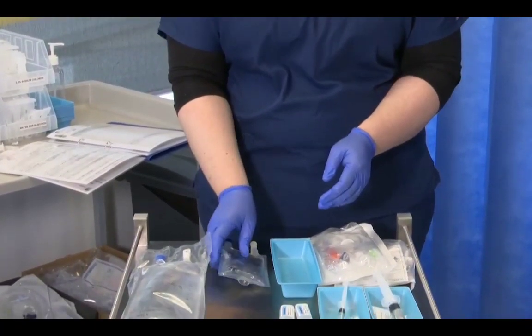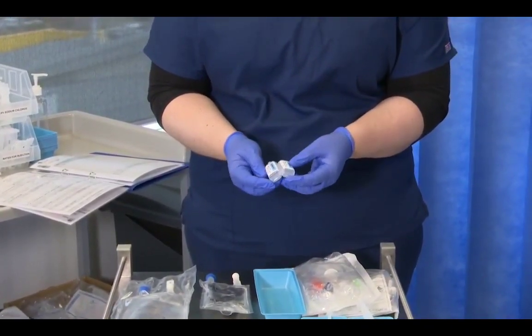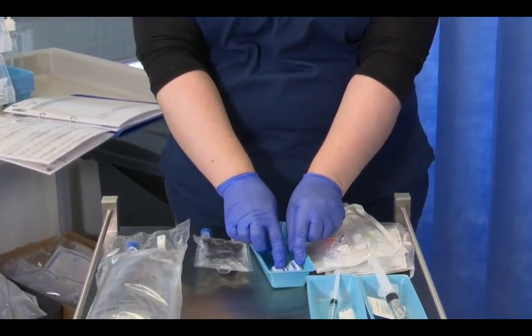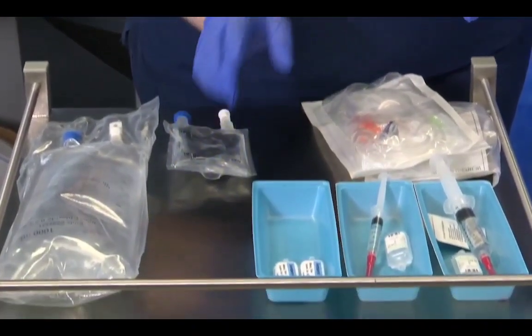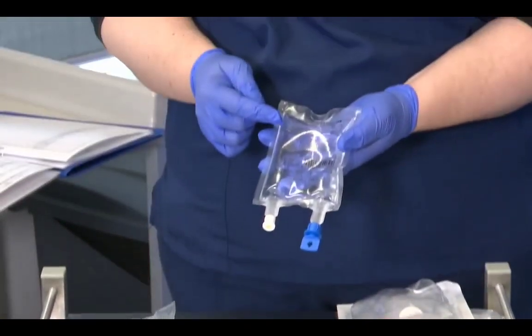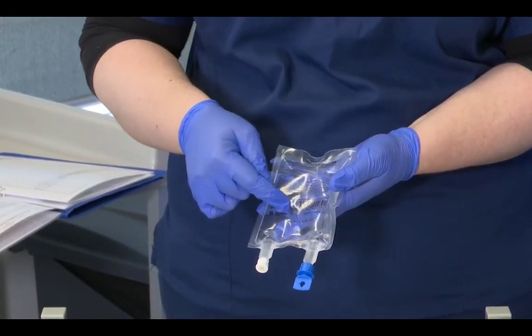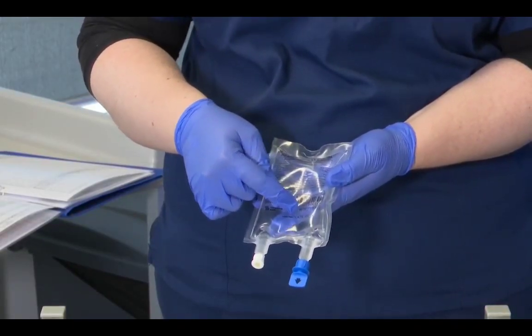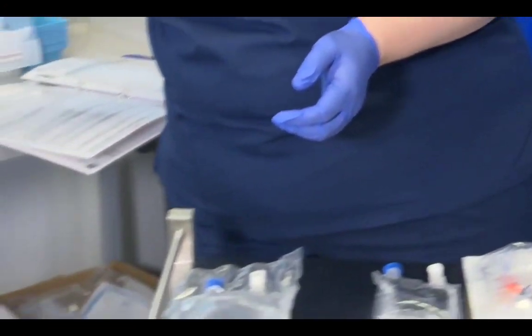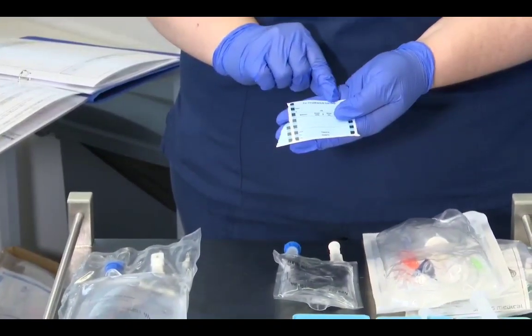The last thing we have to do is complete our label. So the fentanyl ampules, again, we've checked them both times, first when we were gathering it, second when we were preparing it. They go into our blue tray for our third and final check at the bedside. But we do need a blue label to go on our bag. Remembering that the blue label must come underneath the name of the fluid but above the batch number. So we must be able to see the batch number and the name of the fluid. So I'm going to gather a label from the treatment room. And we want a label that's for intravenous use.